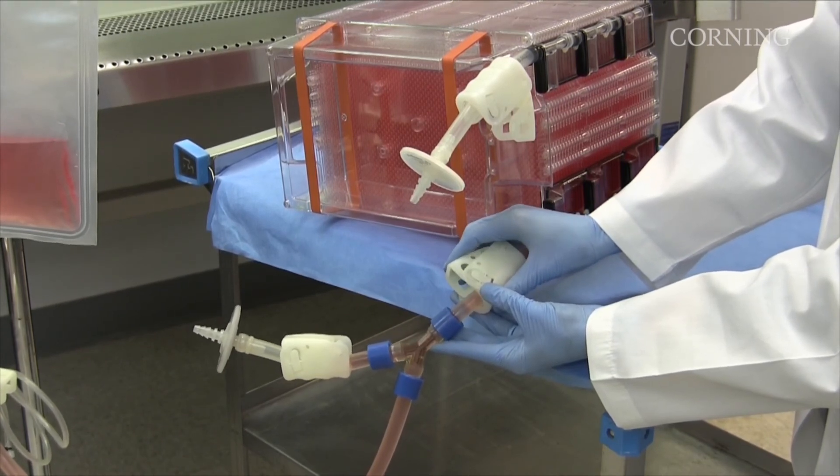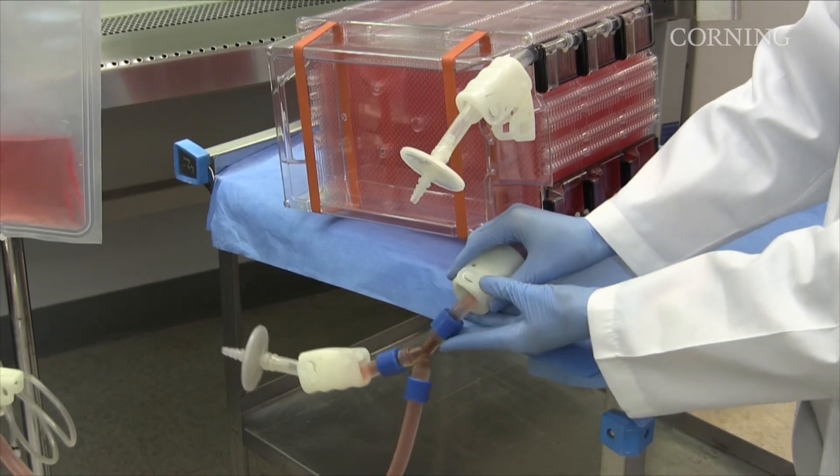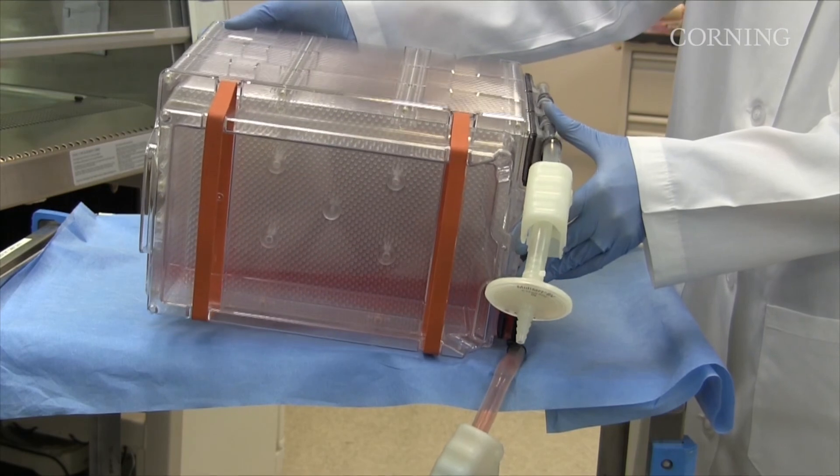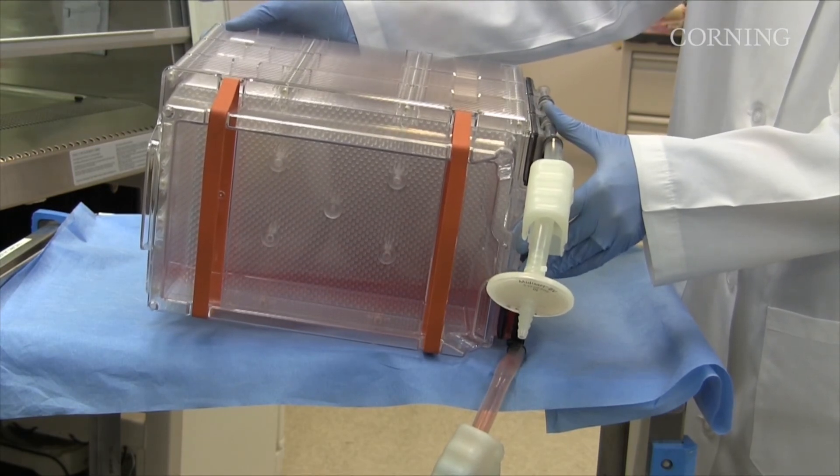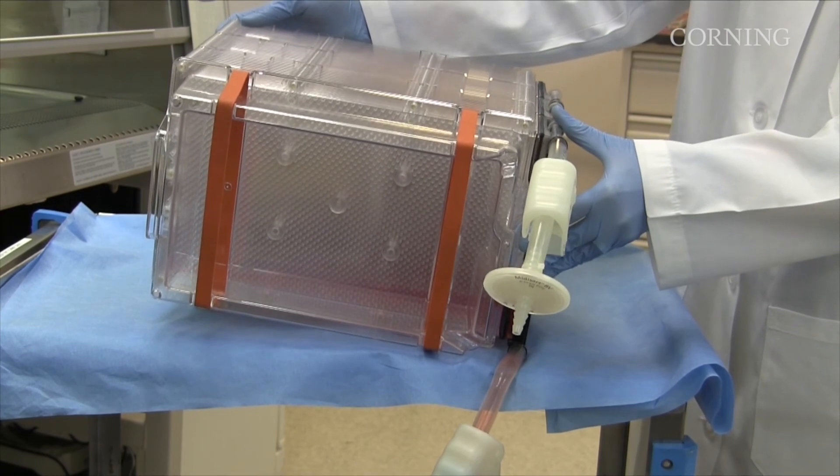If liquid drains too quickly, a vacuum will be created inside the vessel that can damage the cells and the vessel. During the empty procedure, elevate the back end of the HyperStack vessel using a clamp or small object to about a 10 degree angle. This will ensure that the HyperStack vessel drains completely.